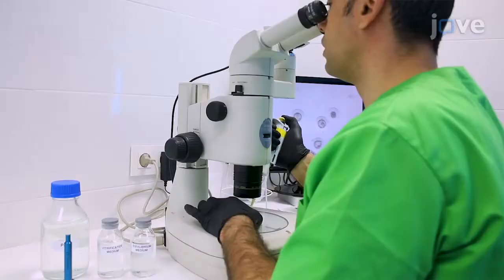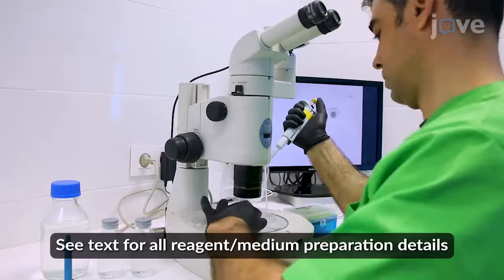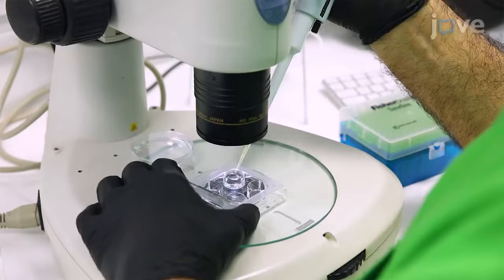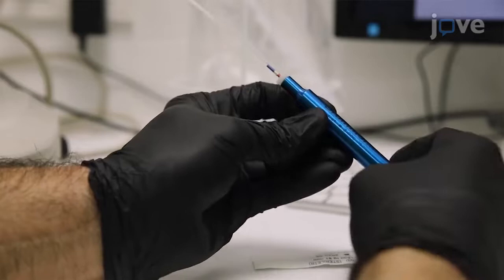For embryonic vitrification, immerse the embryos in equilibrating solution for 2 minutes, followed by a 1-minute incubation in vitrification solution. At the end of the incubation, load the embryos into a 125 µL plastic mini straw and couple the closed end of the mini straw with an appropriate 1 mL micro dispenser.